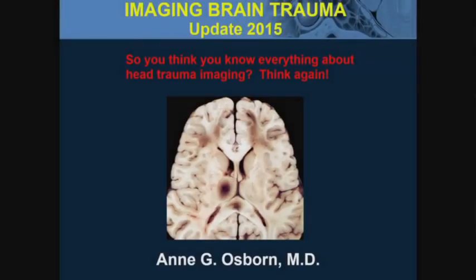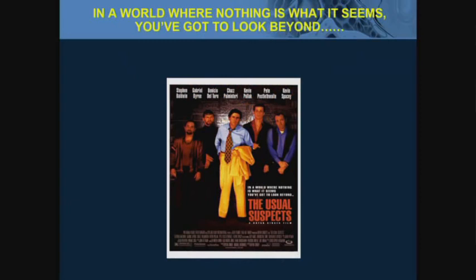So we're going to move from the spine to the brain, and I'm going to talk a little bit more on some different aspects of trauma imaging and subtitle this: so you think you know everything about head trauma imaging, maybe we ought to think again.